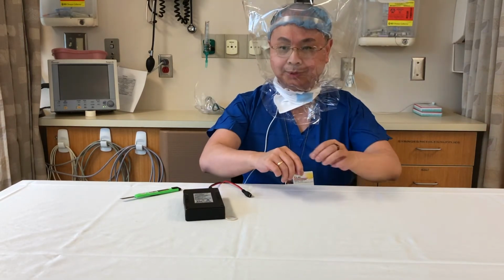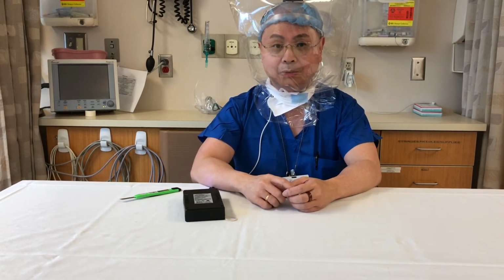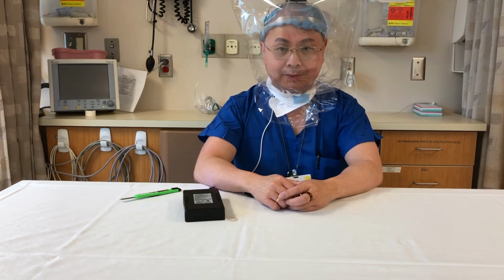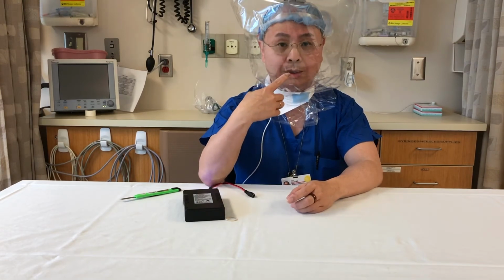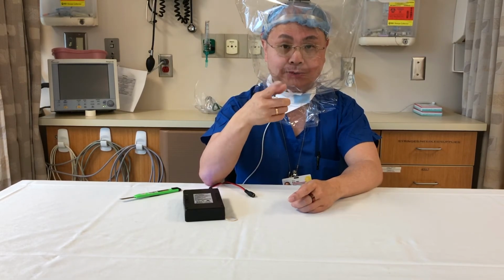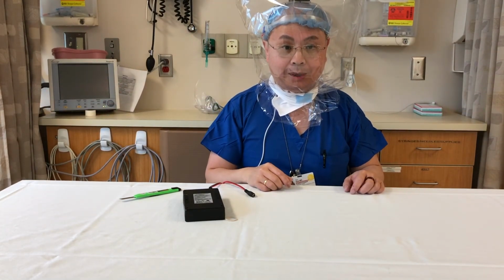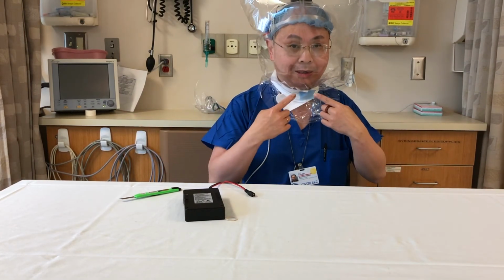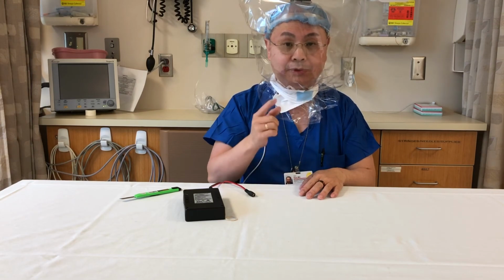Oh, one more thing. I'm not wearing a surgical mask under this PAPR. I'm only doing that because we're doing a video and it's easier for you to understand me if you can see my lips move. But if you were to wear this in an actual patient environment, you actually should wear a surgical mask underneath the PAPR, or rather inside the PAPR. And the reason for that is, well, the PAPR protects you from anything in the environment around you. There's nothing that protects those that are in the room from anything that you breathe out. So that's why you should have a surgical mask inside the PAPR if you're actually using this.